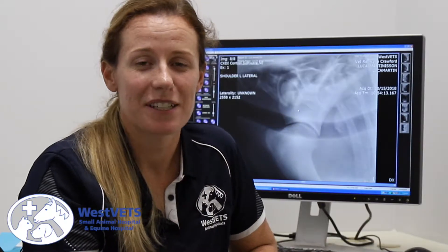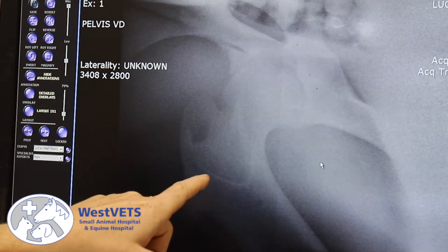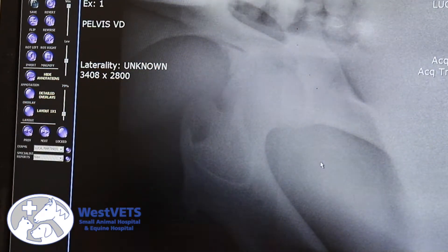Today we're going to treat Luca. She is a yearling filly that has sustained some injuries to both her hind end and forelimb. This is an x-ray of Luca's hip joint, the coxofemoral joint. This is the socket, this is the ball, and this triangle here is where the fracture is — a fracture of her acetabular rim.